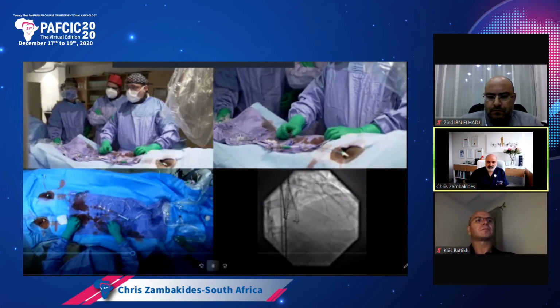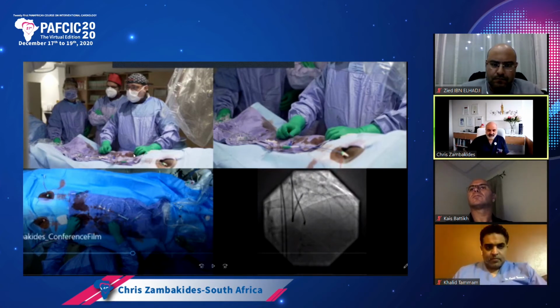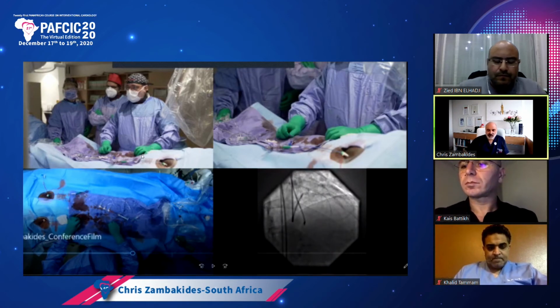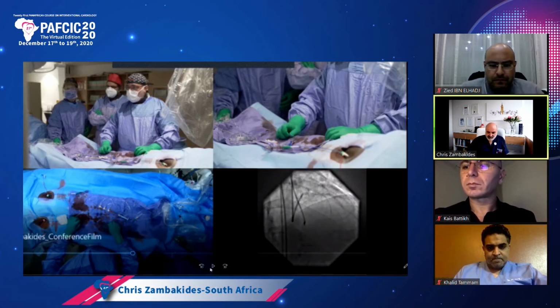Okay, so if you see the way that we're going to advance the microcatheter, especially the Corsair, remember it's got that corkscrew effect. It will grip, it will dilate, and it's going to advance. With one hand, you're going to be rotating, mainly clockwise, and every now and then you give it a few anti-clockwise rotations. With your other hand, sitting at the hub, you're gently advancing and pushing forward, and you're going to see how it advances on.